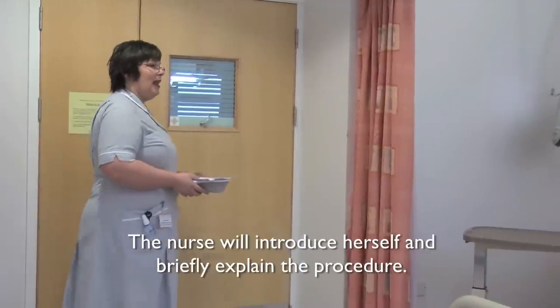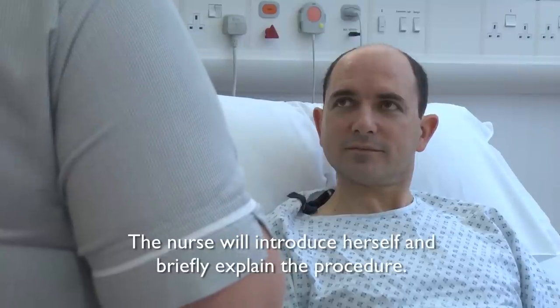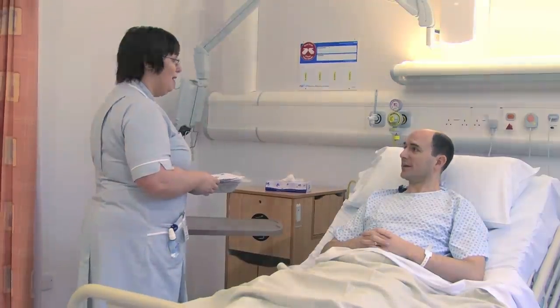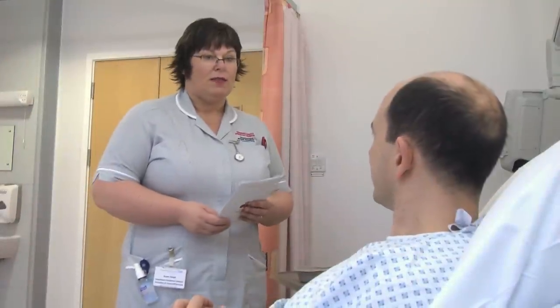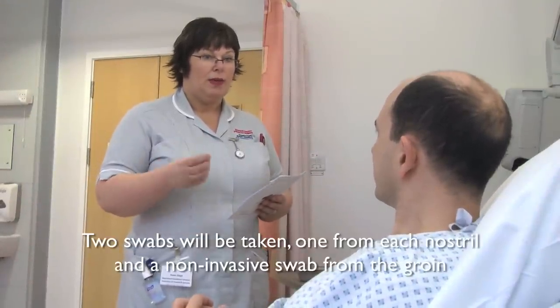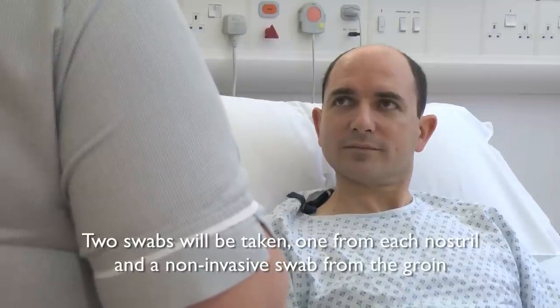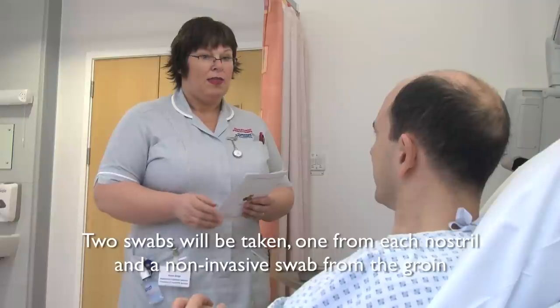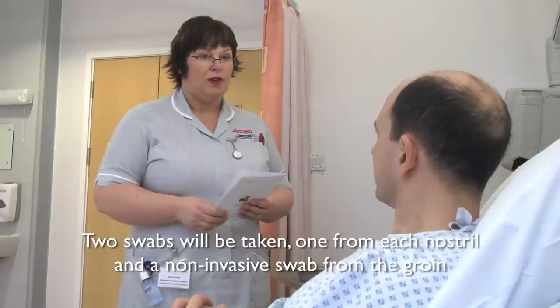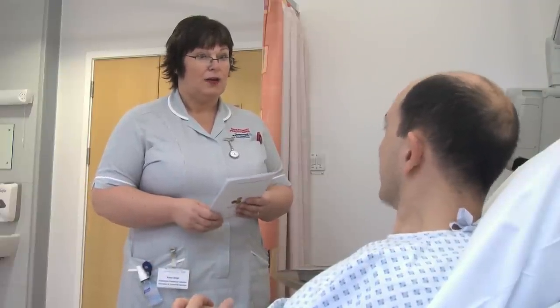Morning, is it Mr Campbell? Hello, my name is Susan. The staff nurse has asked me to come in this morning and do your MRSA screening for you. Is that alright? Yeah, that's fine. What it involves is me taking some swabs from your nose — just one swab that will go inside each nostril. It's not painful; you might feel a bit of discomfort, that's all. Other than that, it'll just mean taking a swab of your groin, which is down below in the top part of your leg. Is that alright? Yeah, that's fine.